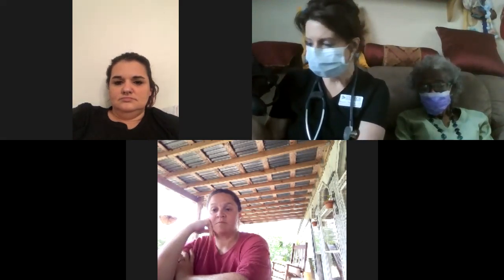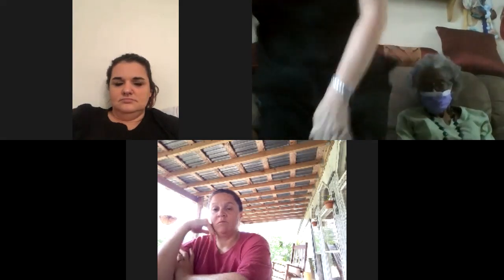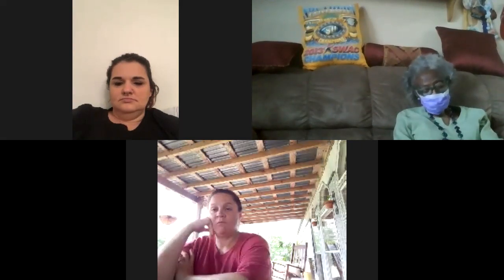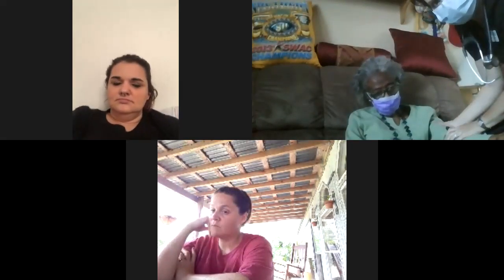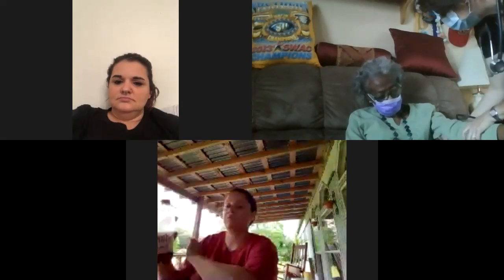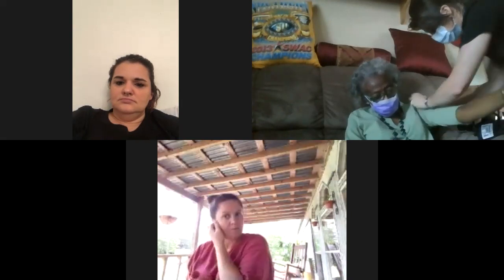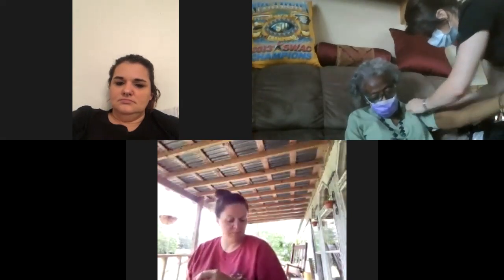So I'm going to go on the other side of our patient because I need to take the blood pressure in her left arm. And a blood pressure is most accurate if she doesn't have a long sleeve shirt on. So is it okay if I lift your sleeve above your arm? Okay. So I'm going to have my patient relax her arm on a flat surface.